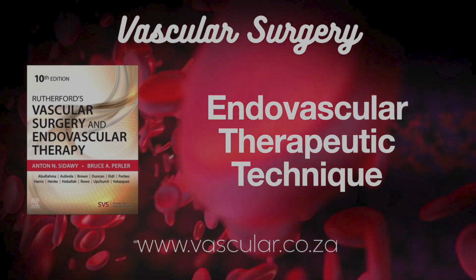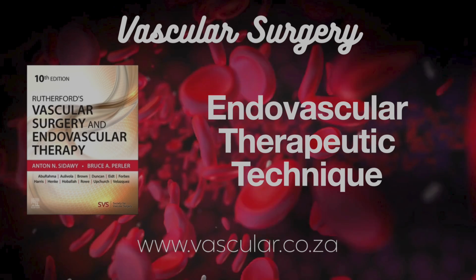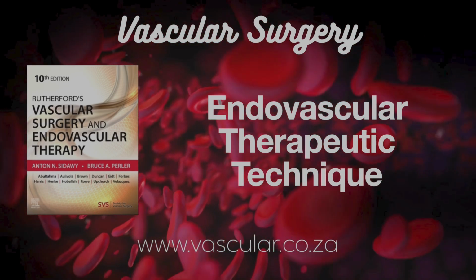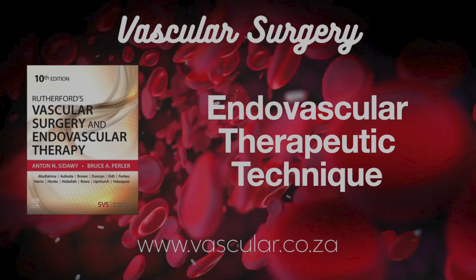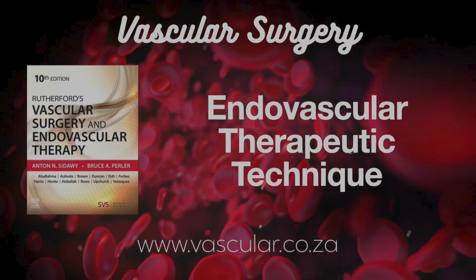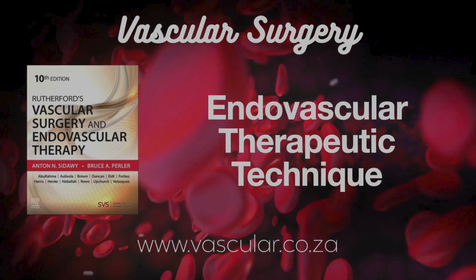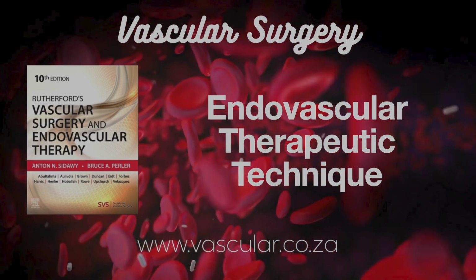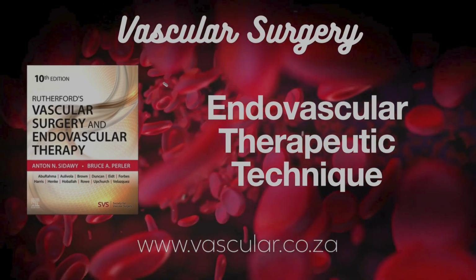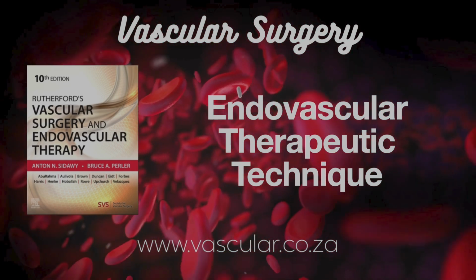Very intricate work. Okay, so after all these procedures, balloons, stents, atherectomy, thrombectomy, you need to close the hole in the artery where you went in. Access site closure, a critical final step. Absolutely crucial. Access site complications, bleeding, hematomas, pseudoaneurysms are a major cause of problems after these procedures. Manual compression, just holding pressure, is the traditional way. But it takes time, doesn't always work. Exactly. Time-consuming, uncomfortable, can fail, especially with the larger sheaths used for complex stuff like EVAR or TAVR.